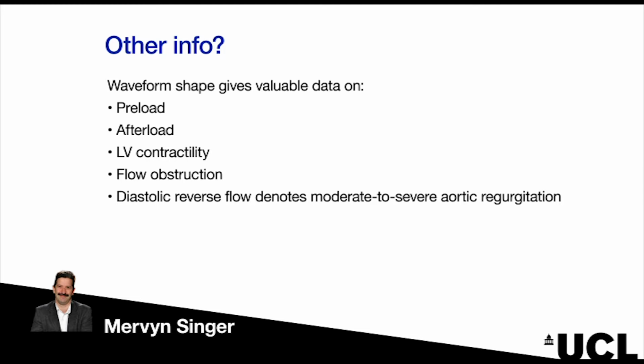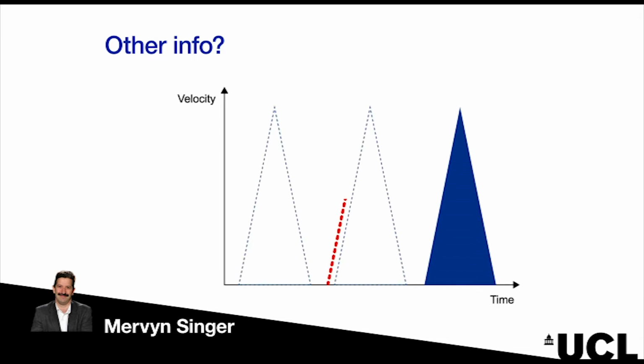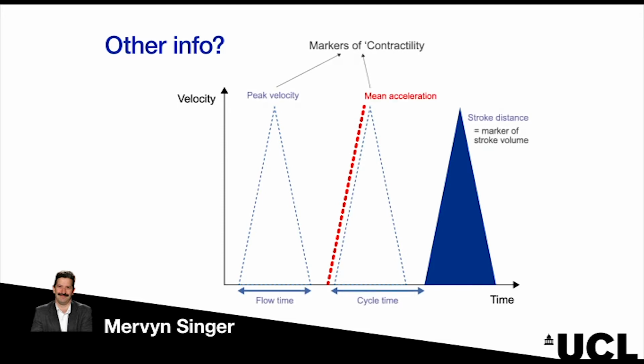And if you see a reverse flow going the whole length of diastole, you only see that in moderate to severe aortic regurgitation. So it's fairly diagnostic that the patient has a big problem with their aortic valve, whether it's trauma, endocarditis, or whatever. So when you look at the waveforms, you can measure the stroke distance, which is a marker of stroke volume, and this nomogram I just mentioned translates that into a measure of stroke volume. The mean acceleration is the upstroke of the waveform, which is a marker of contractility, as is the peak velocity, which is the apex of the waveform.